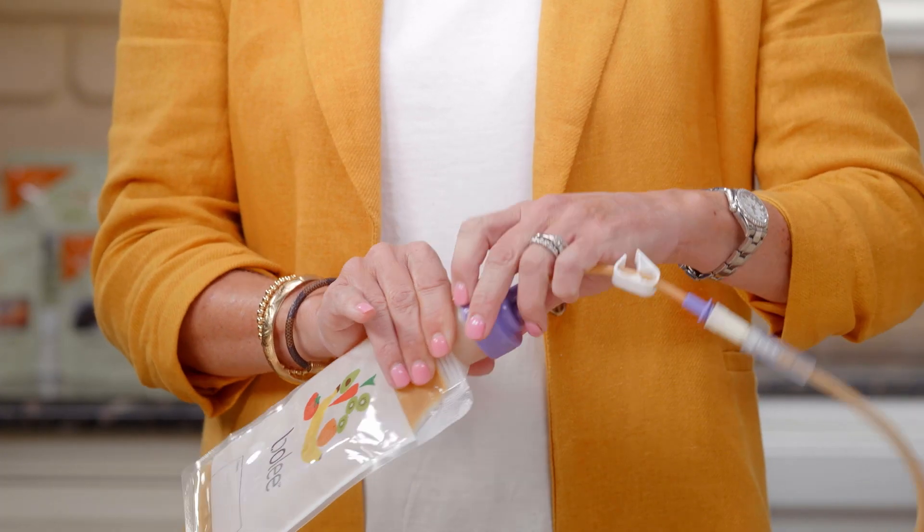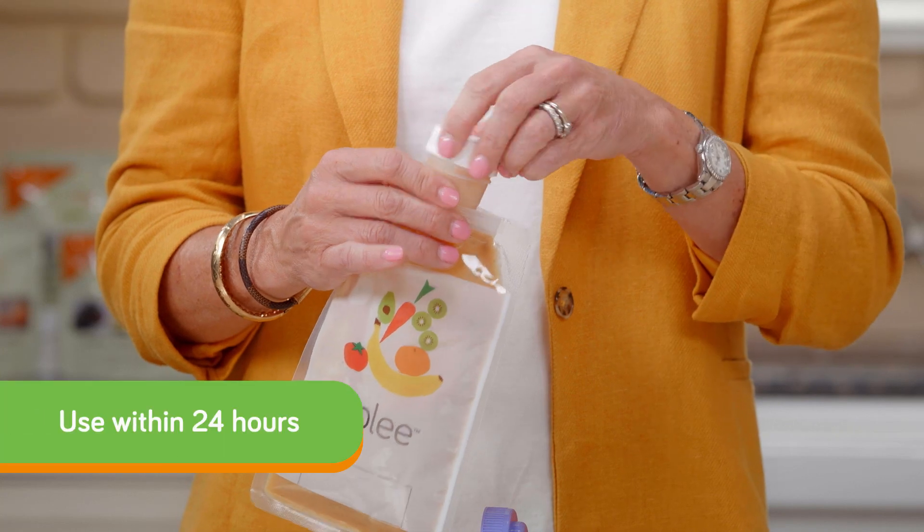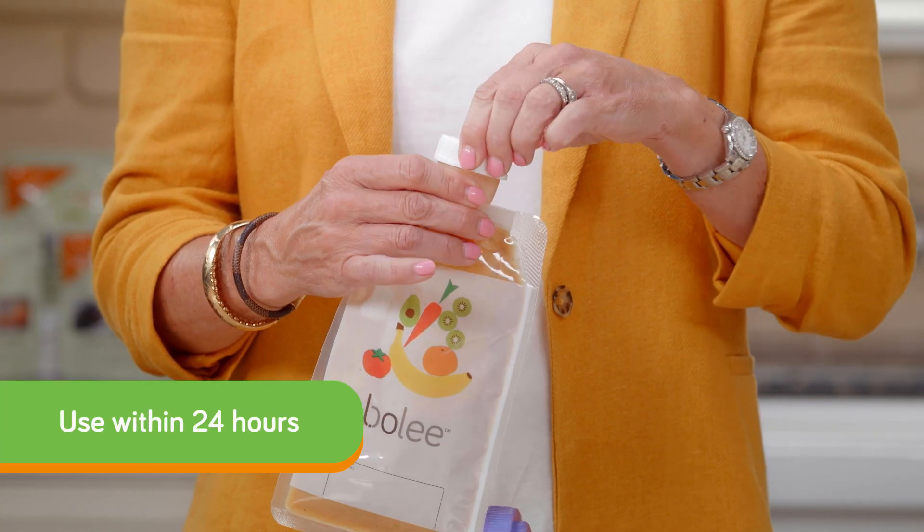The bolus bag system does include a storage cap, and any remaining product can be refrigerated and used within 24 hours.